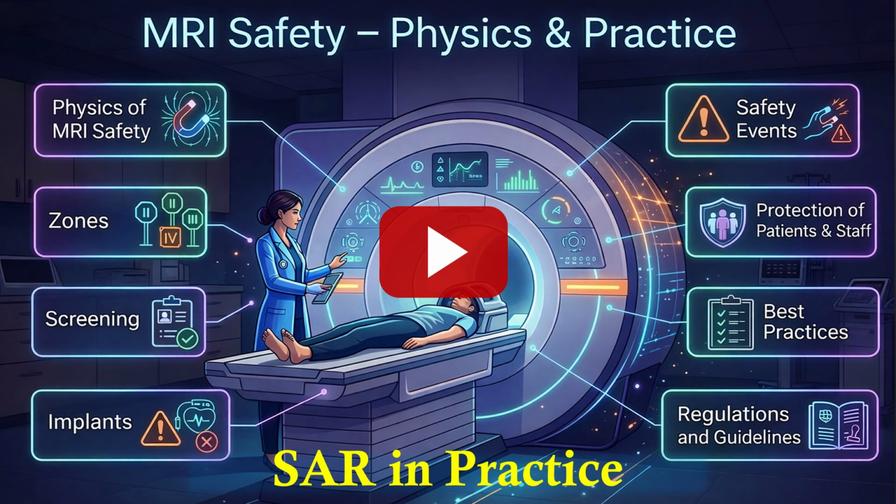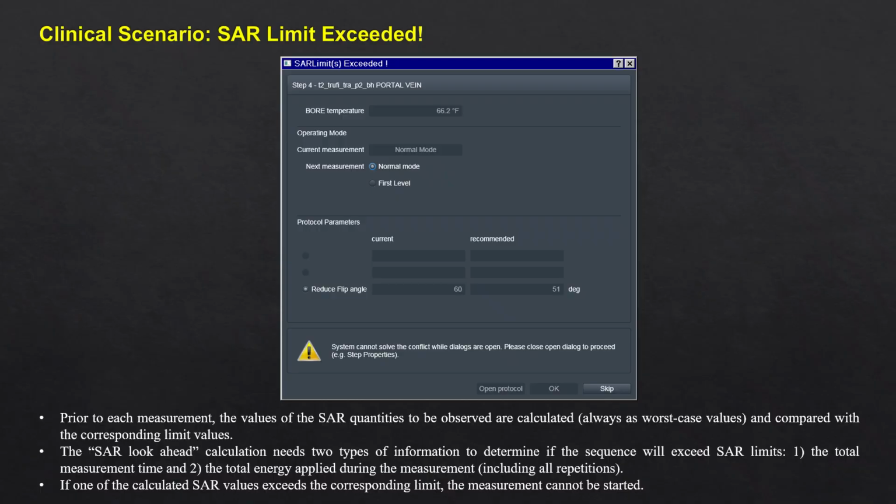Welcome back. Today we talk about how to lower SAR in clinical practice. If you are an MRI technologist or MRI scanner operator, you may have seen the message, "SAR limit exceeded," pop up during an MRI scan. This warning can stop you from proceeding and may interrupt your workflow right at the scanner console. So what does it actually mean?